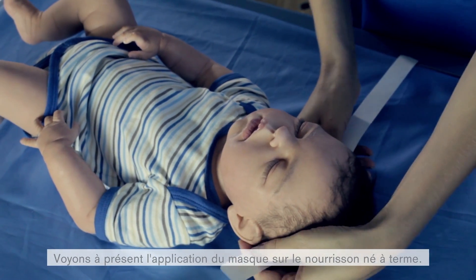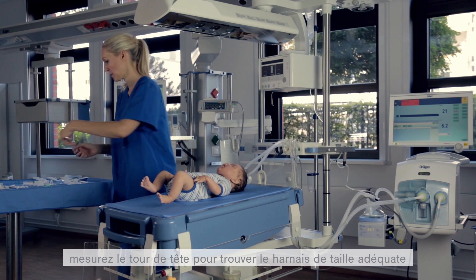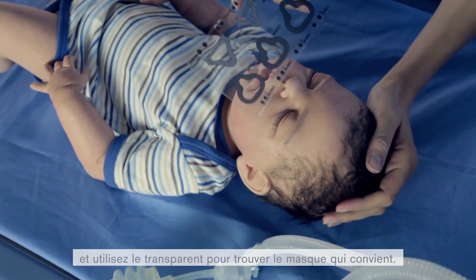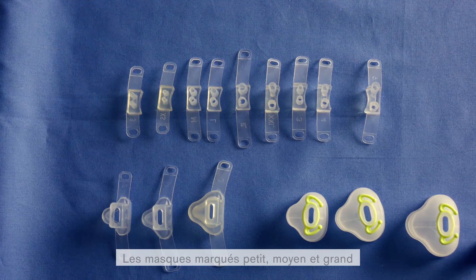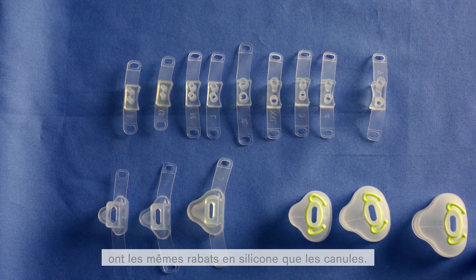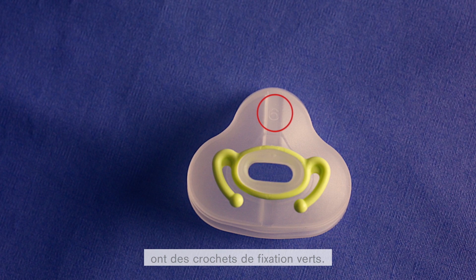Now we will show the mask application on the full-term size infant. As previously demonstrated with the neonate patient, measure the head circumference for the appropriate headgear size and use the sizing card to find the best size for the mask. The headgear setup is the same as previously demonstrated. The masks labeled small, medium, and large have similar silicone flaps as the prongs. The masks for larger babies in sizes 4, 5, and 6 have green clips for securing purposes.